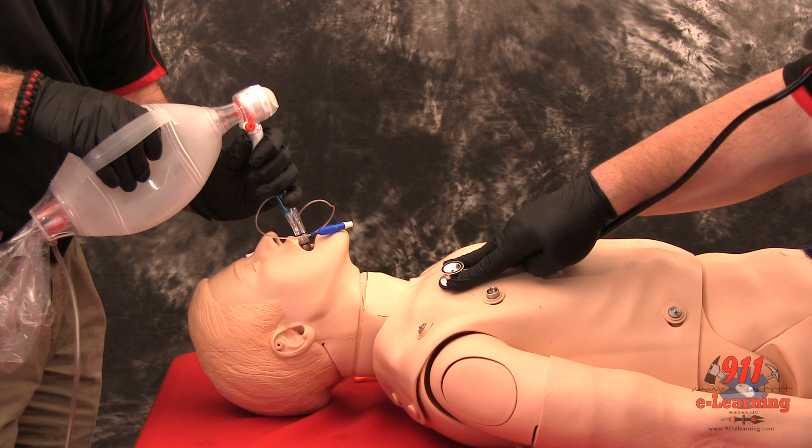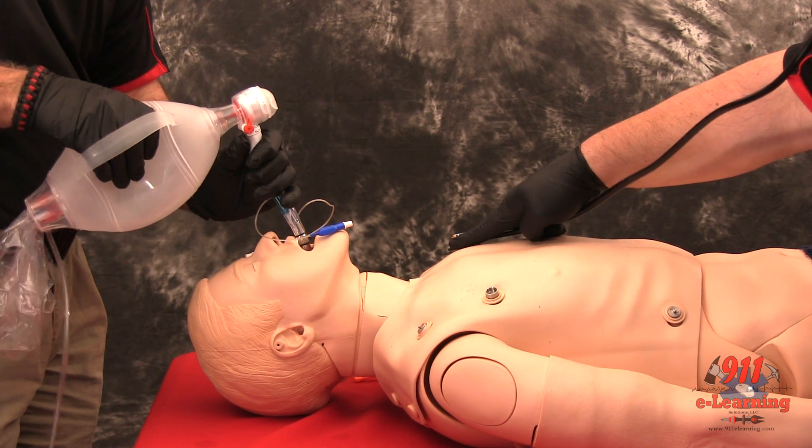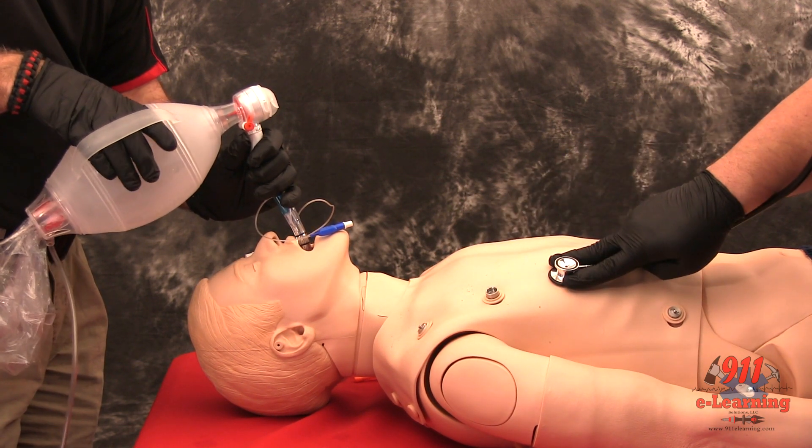If breath sounds are positive and epigastric sounds are negative, continue ventilation through the blue tube. The tube is in the esophagus.